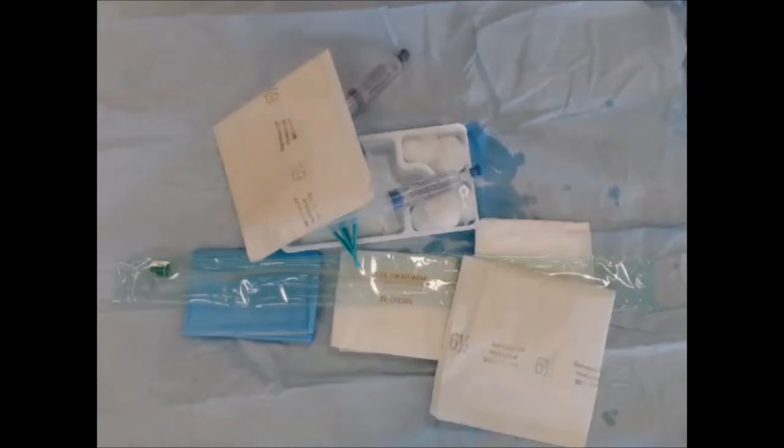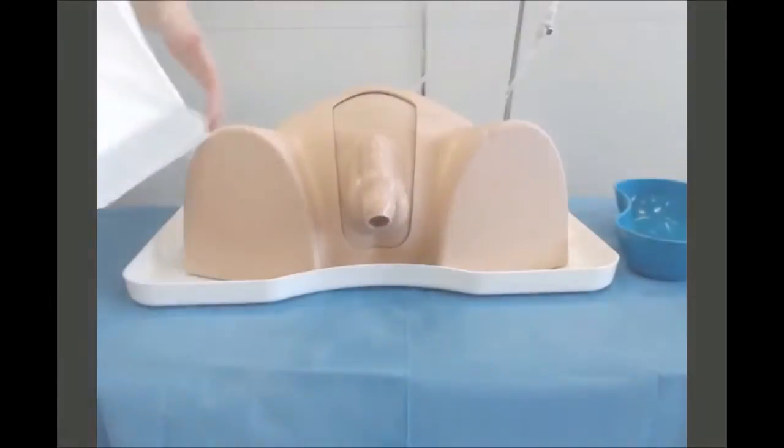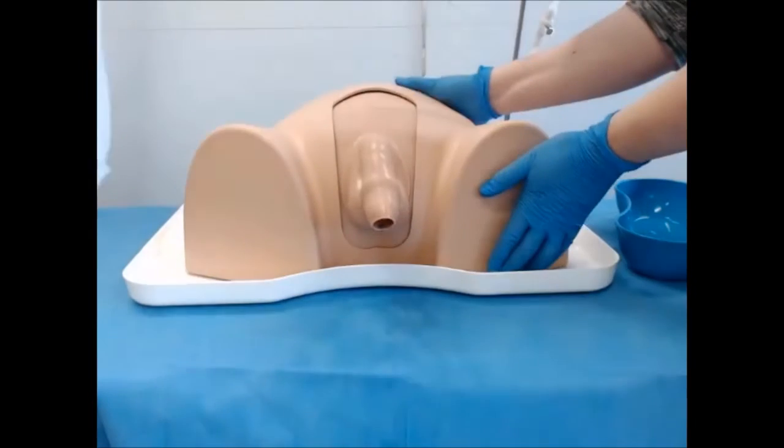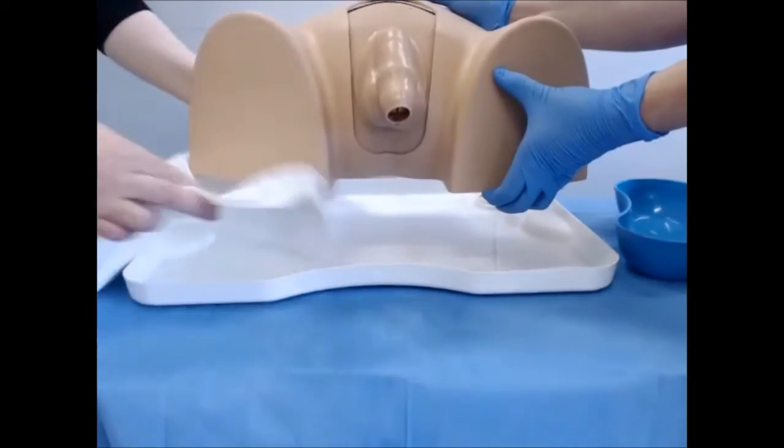Check you have everything in place: check you have water, check you have the right catheter, and check that your urine bag is close to the patient. Then prepare the patient and place an Inco sheet under them. Remove the patient's clothes and bed clothes and place the Inco sheet underneath. You may need a nurse to help lift the patient, or the patient may be able to do it themselves. This is very important to protect the bed as it can be a little messy.